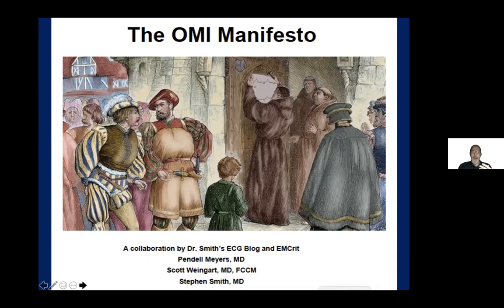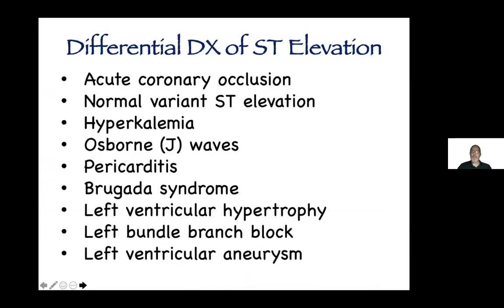However, I can't say that all systems are doing that, because when we talk about bundle branch blocks, we're going to talk about the Sgarbossa criteria, for example, which there are agencies across the country and regional systems that utilize in making a determination of whether or not they're going to take somebody to the cath lab. So right now, the terms STEMI and NSTEMI are still the terms of the day. But if you follow the literature and read some of this stuff that's out there, that's changing in a lot of minds of a lot of people.